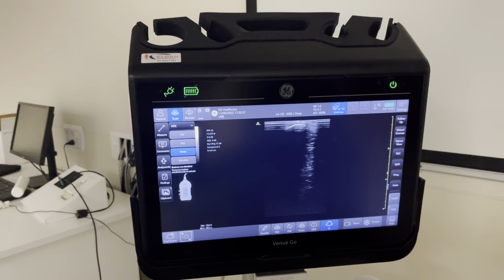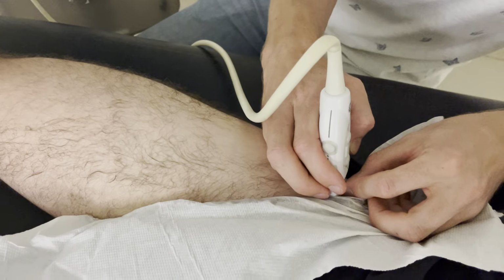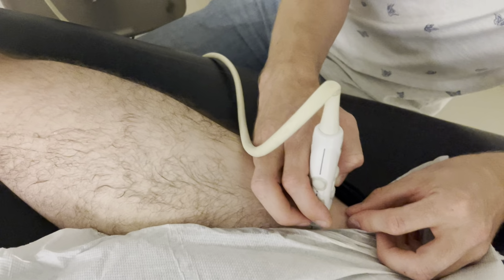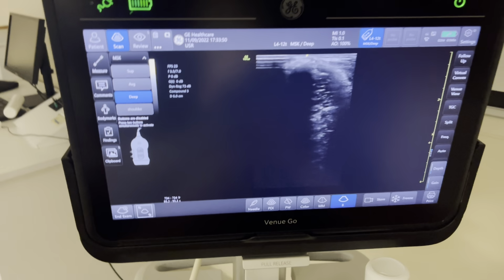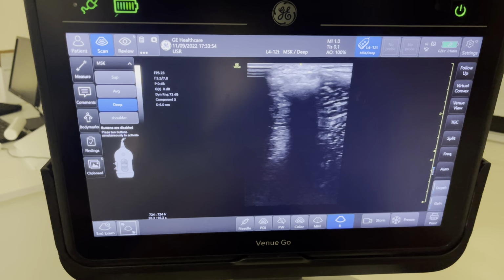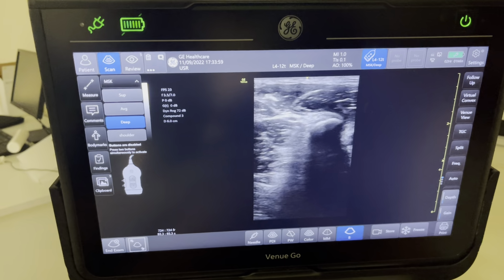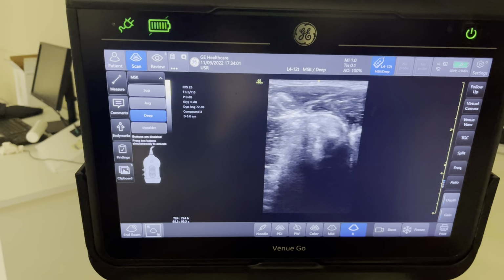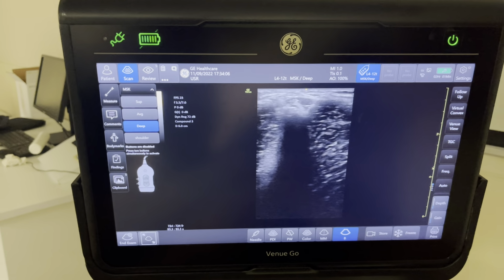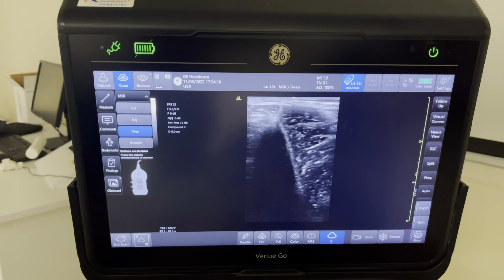So I go down maybe 5 centimeters, just like this. You can make this move a bit quicker, just to get an idea of what is Sartorius and what isn't. So I make this move, I go down. At this stage, it's quite hard to distinguish the Sartorius, but if I go a bit further, there appears a muscle belly and another one. So one is the Tensor and one is the Sartorius. So I go up again, follow the fibers, go down again.